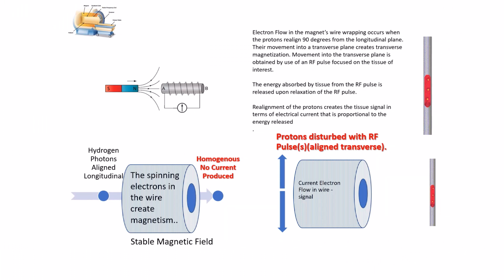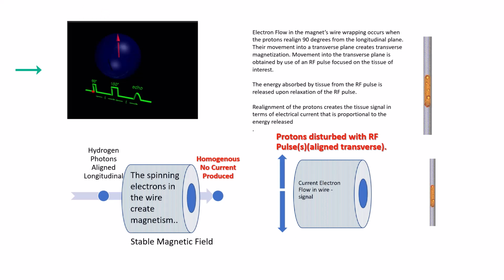So now we've seen how the body has been magnetized and mapped using gradient echoes. Let's now look at the addition of the pulse sequence to be able to gather the data we need for our images. Here we see a representation of a spin echo pulse sequence.